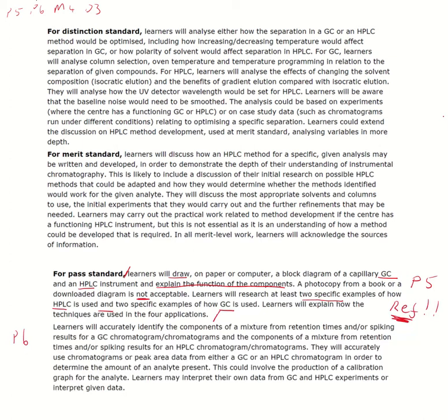So what you'll be given is some spectra where it's got the various spikes on it, and it's a case of, say, based on the information, if cocaine comes out at 5 minutes, you're looking at the spectra, and does the spectra have a peak at 5 minutes? Can you say if cocaine's present? It may be another thing as well with sort of working out the amount of it.